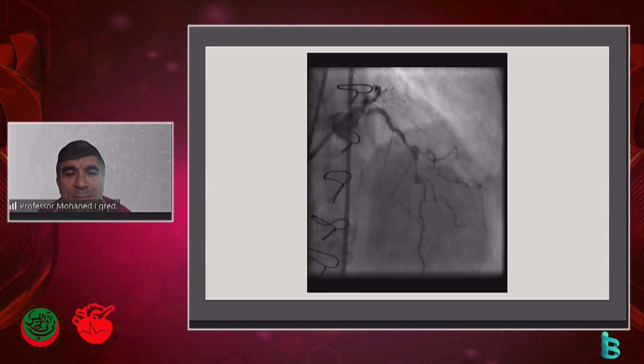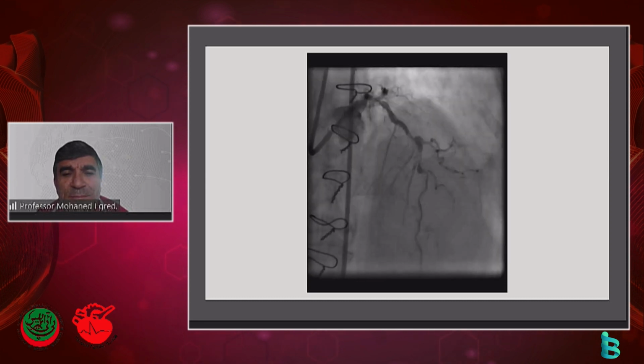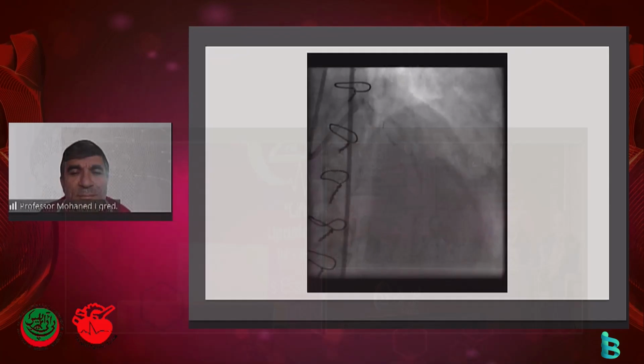So probably what you would end up doing is having a stiffer wire or something like that go through it. Once your channels are defined, I don't think, as far as the proximal calcium is concerned, it's going to make much of a difference. It's that little bit in between that is the biggest challenge.